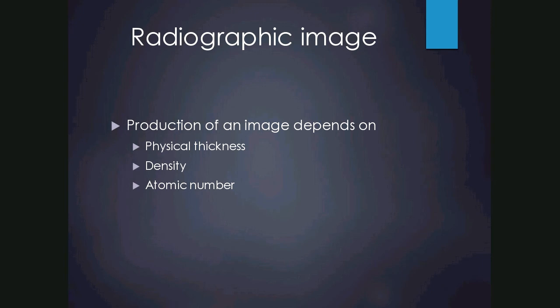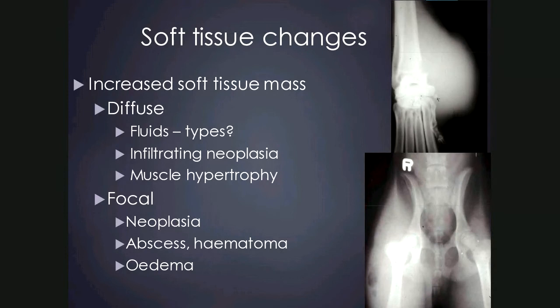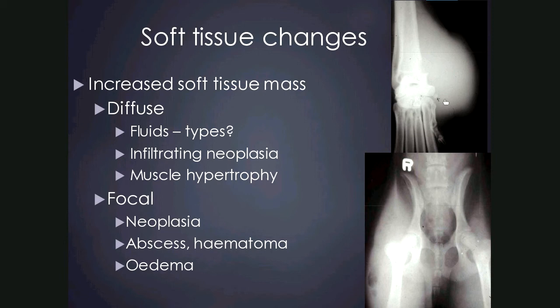We can get soft tissue swelling or increased soft tissue mass, which may be diffuse or focal. Diffuse changes might be due to fluids such as inflammatory fluid like cellulitis, infiltrating neoplasia, or muscle hypertrophy. Focal soft tissue swelling could be a neoplasm, abscess, haematoma, cyst, or oedema. In the image here there's a large focal soft tissue swelling over the distomedial radius and the carpal joint area. In the pelvis example there's large generalised soft tissue swelling over the right pelvic limb with gas opacities, probably a cellulitis with abscessation.